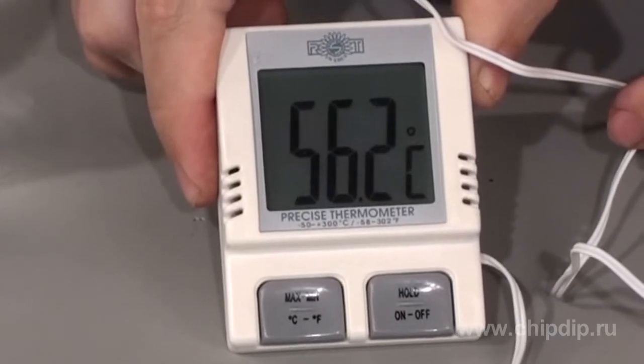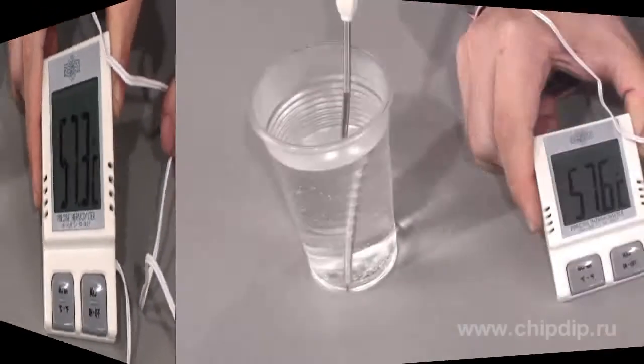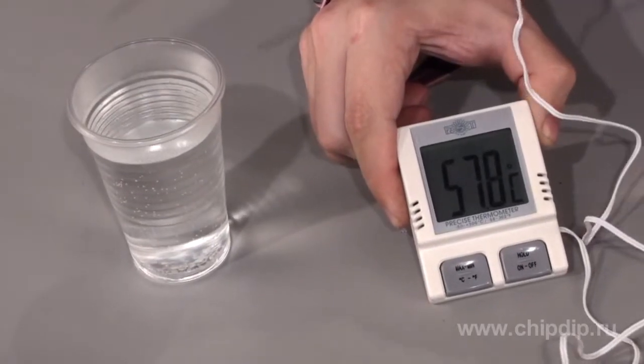When the temperature changes, the indicators on the display will change too. After the measurements are completed, cool the probe of the thermometer.